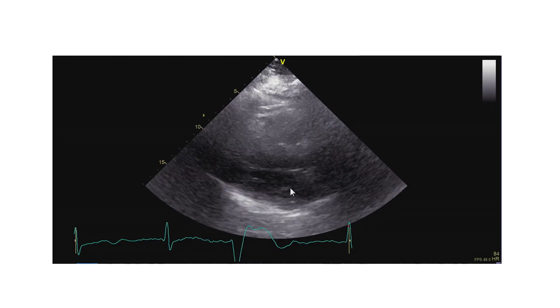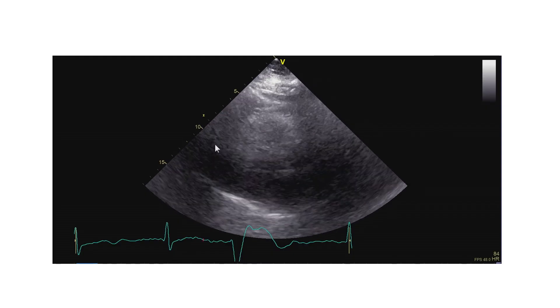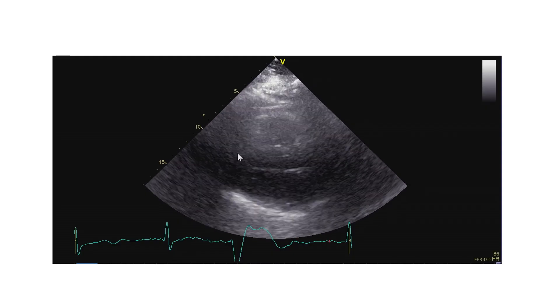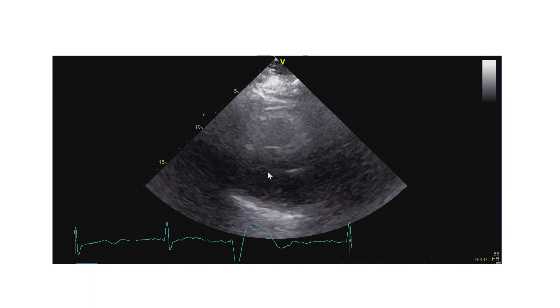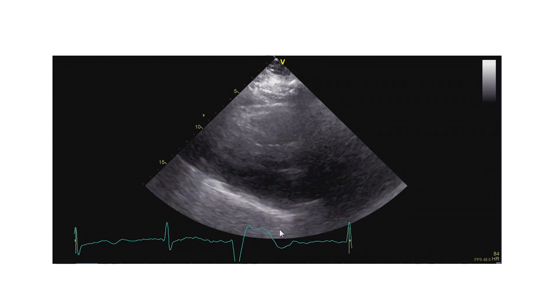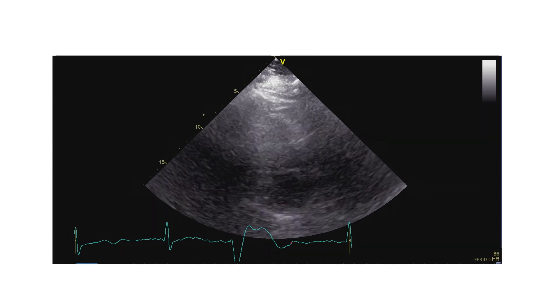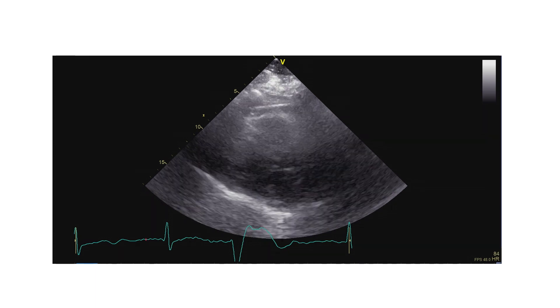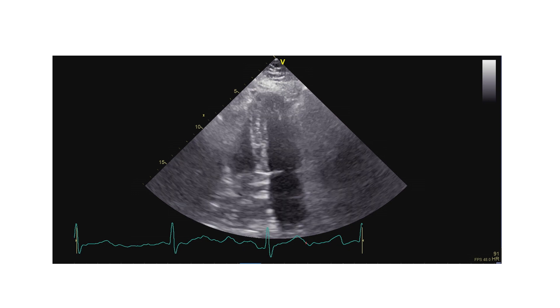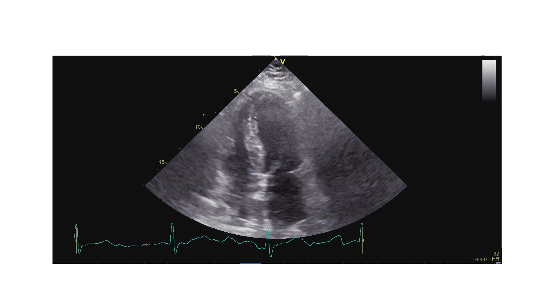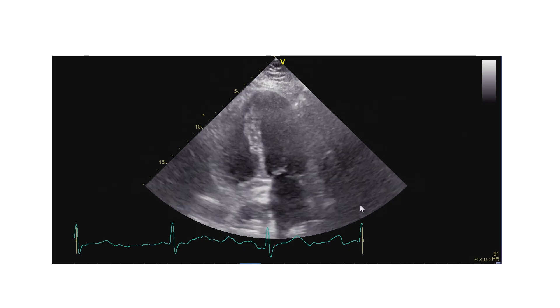Here is the echocardiogram. The parasternal window does not really give very good image quality, so it's difficult to see what the patient really has. But luckily we do get better images from an apical approach, and here it is.